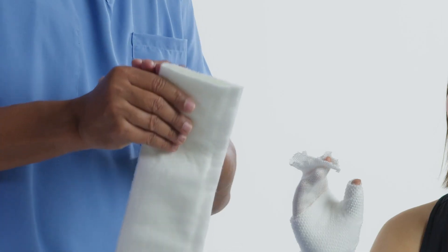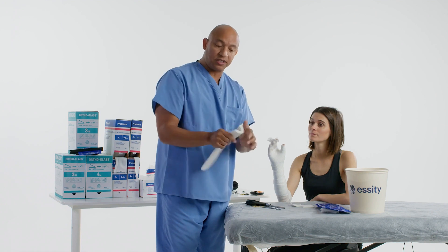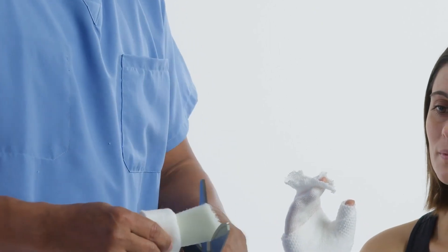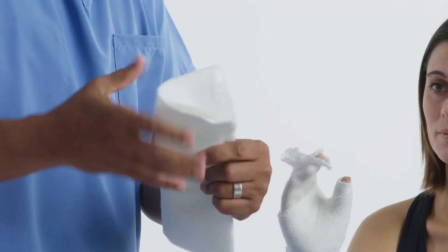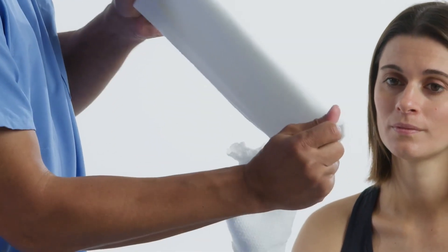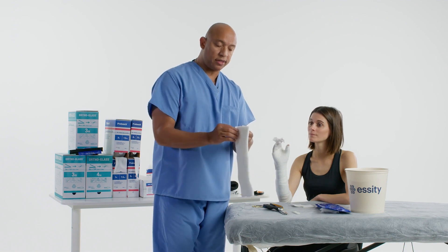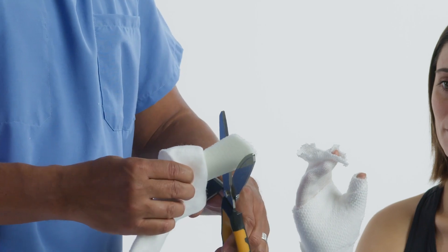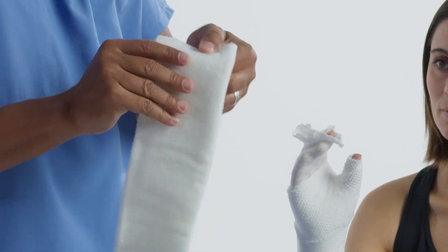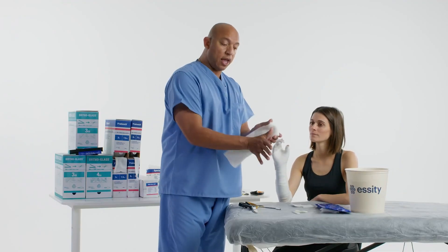Go ahead and remove your ortho glass from the package. If you notice, this is the fiberglass hanging out — we do not want that hanging out, especially for the thumb spica, because we don't want them to touch their face. This is going to get extremely hard. You have two ways to take care of that: you can peel this down and cut down about a quarter of an inch so it's not hanging out, or you can go ahead and stretch the padding past the substrate. You can also cut down more, giving yourself a nice folded edge, making sure there's no way for the substrate to stick out at all. Fold that on the patient and have it secured.